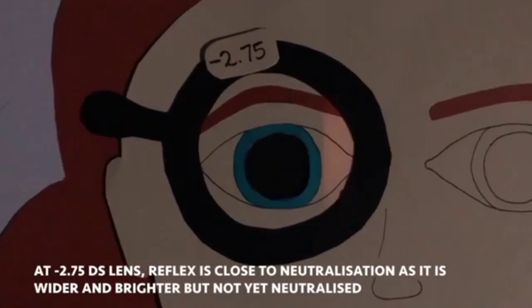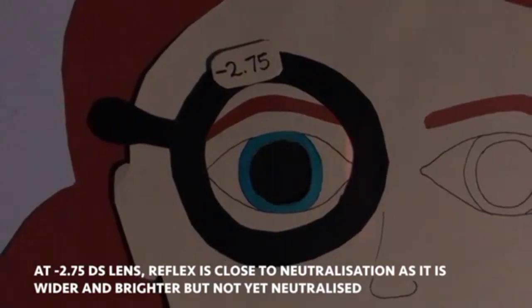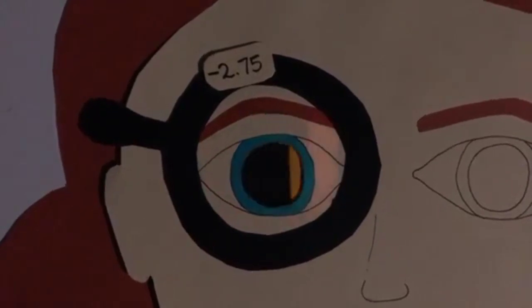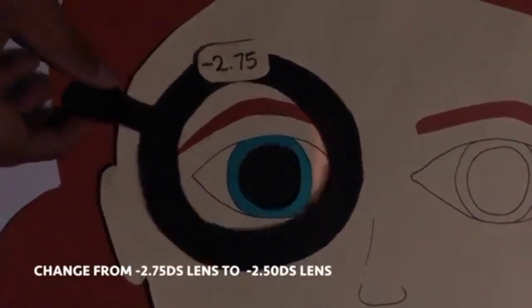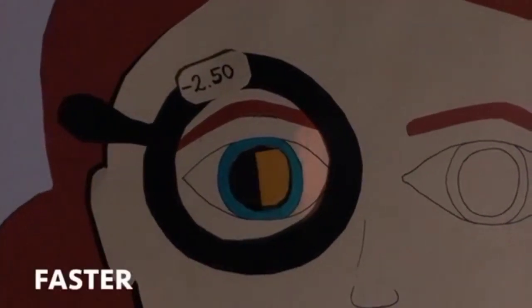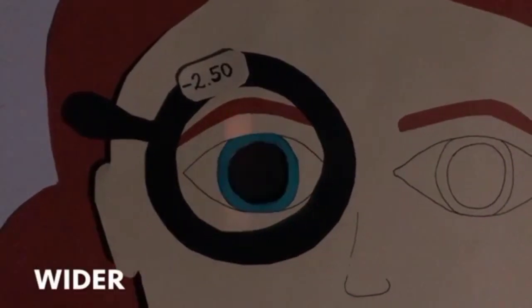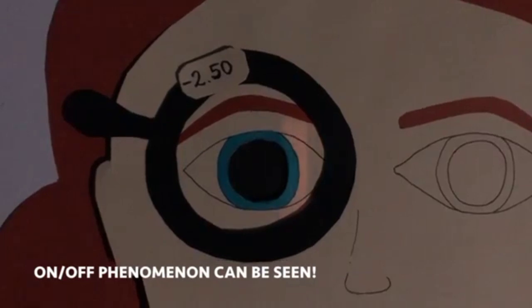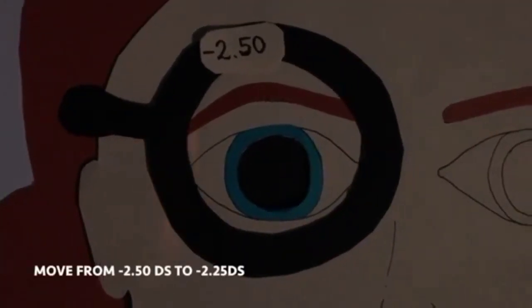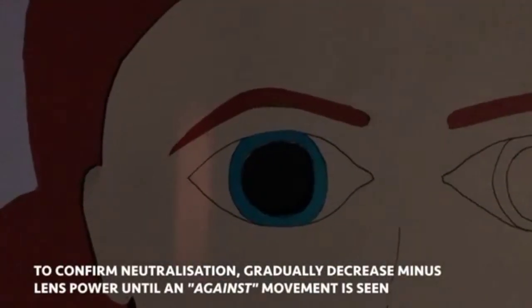And at the minus 2.75 lens power, it is very close to neutralization, but it is not yet neutralized. Now we add the minus 2.5 lens, and we can see the reflex is faster, it's brighter and wider, and the on-off phenomenon is observed. To confirm that neutralization was achieved, move down to minus 2.25 and then an against movement should be observed.